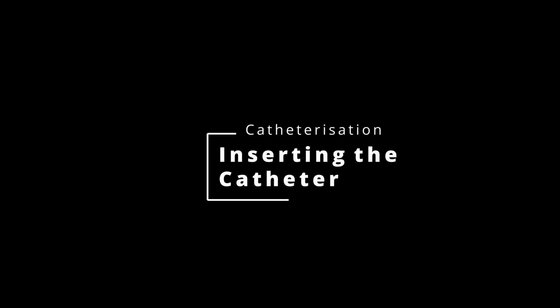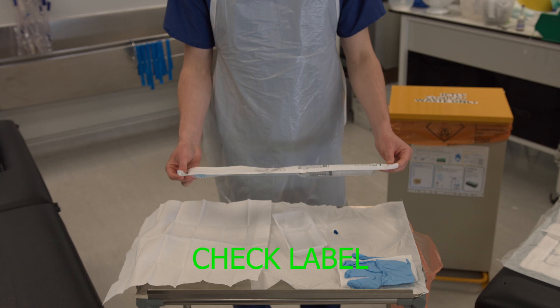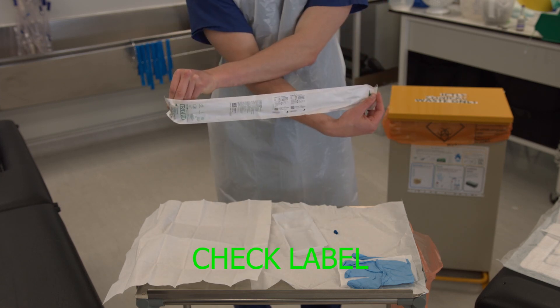This video will show you how to prepare the catheter for insertion into the urethra. To begin with, check the label on the catheter ensuring it is size 10 to 12 French for a female pelvis.